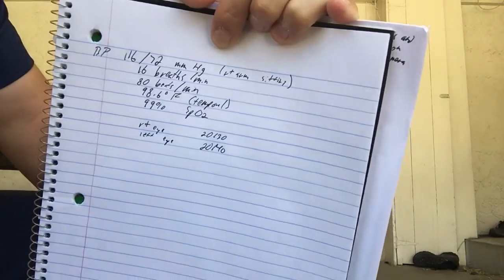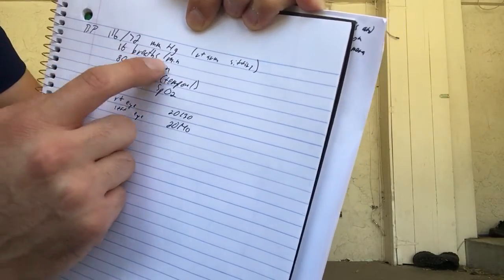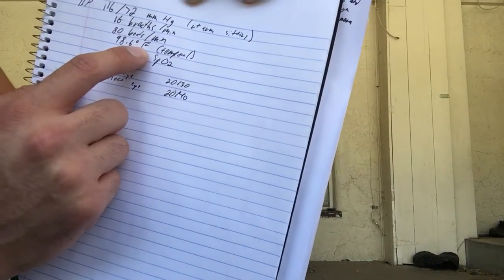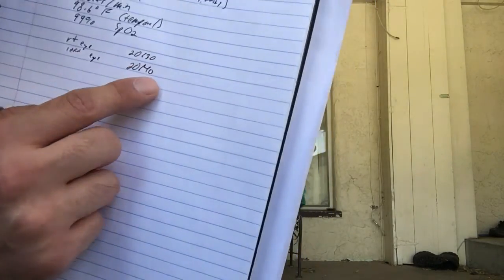So, my charting. Blood pressure 116/72 millimeters of mercury, right arm, sitting. Respiratory 16 breaths per minute. Pulse 80 per minute. Temperature 98.6 degrees Fahrenheit, temporal. SpO2, oxygen, 99%. And right eye 20/30, and left eye 20/40. Okay, so I'm going to begin the assessment now.